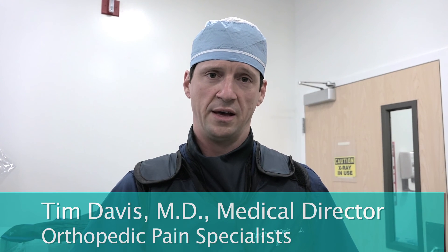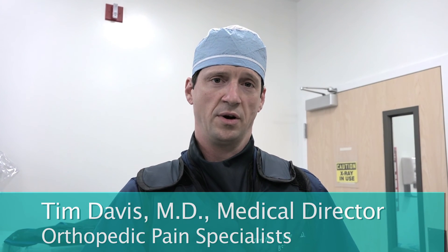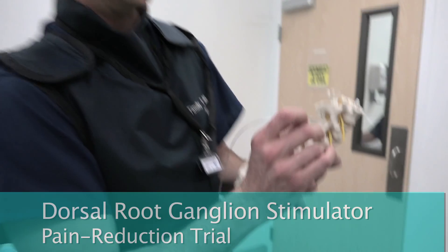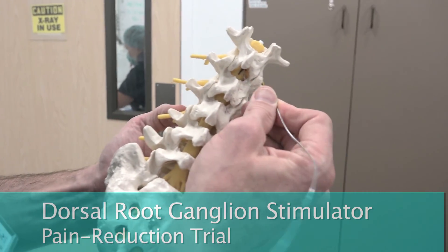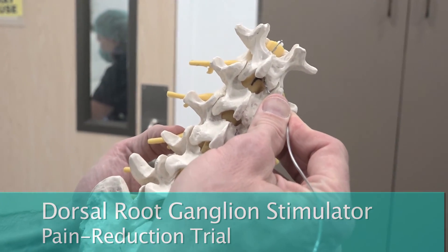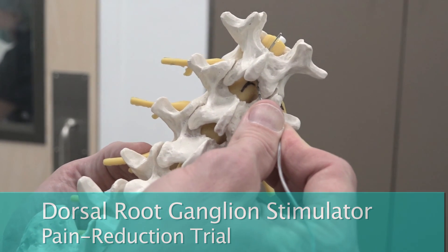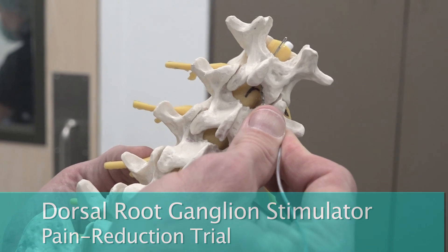Today we have someone with chronic inguinal pain on the left-hand side, so what we are going to do is put in a lead onto the L1 dorsal root ganglion. A traditional spinal cord stimulator placement will be directly onto the back of the dorsal columns. Now what that does is it takes care of regional types of pain, but not specific nerve roots.